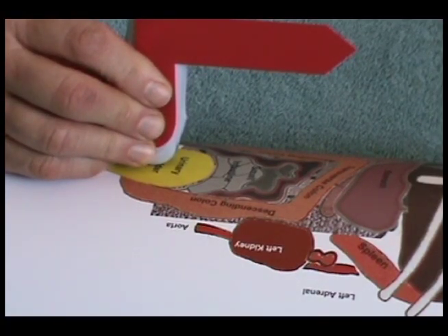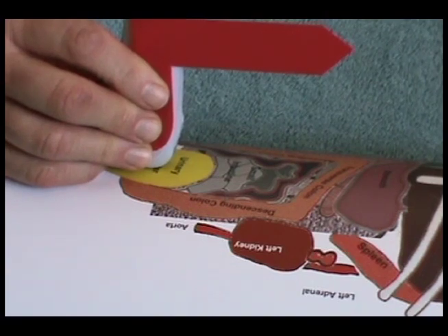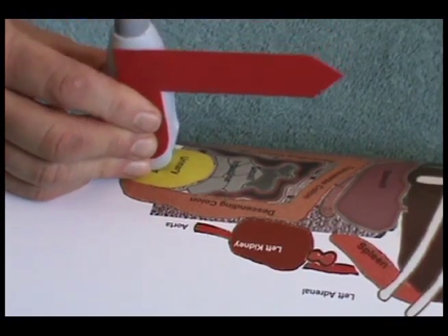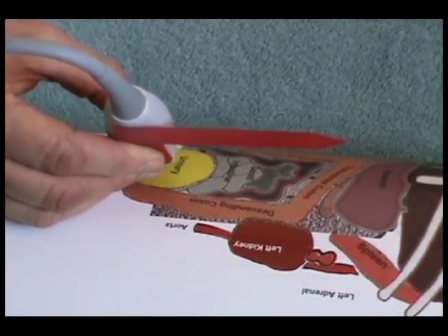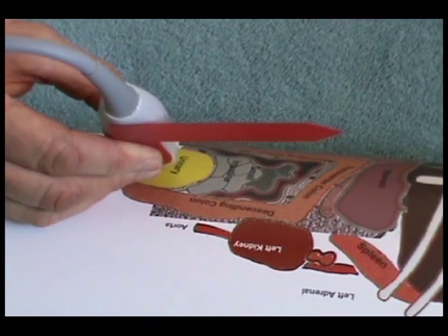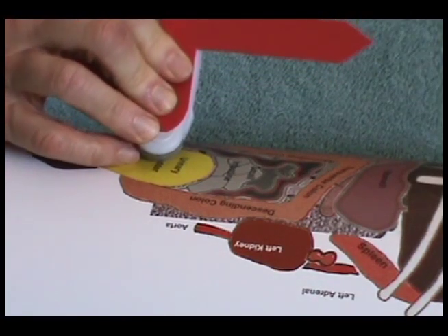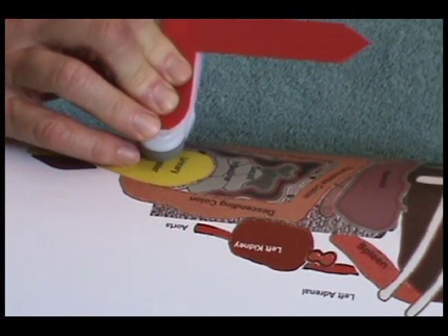Once we reach the urinary bladder, center the bladder under the transducer in a ventral midline sagittal position. Fan the transducer to the patient's right side till the transducer is no longer pointing at the urinary bladder. Then reverse directions and fan to the patient's left side till the transducer is no longer pointing at the urinary bladder.